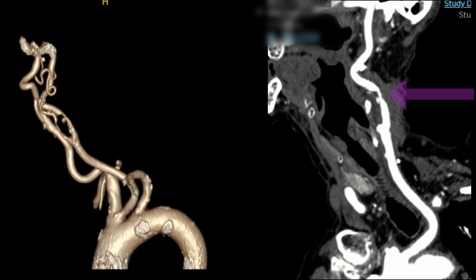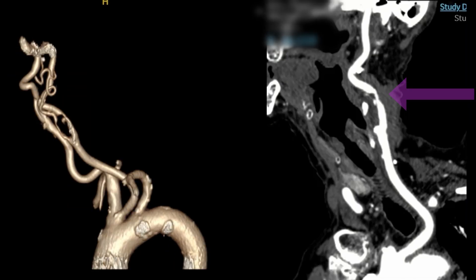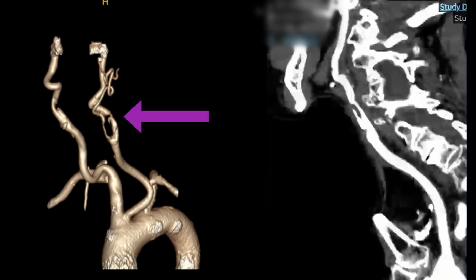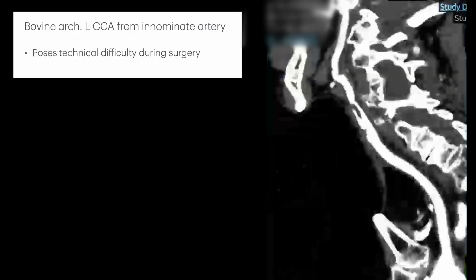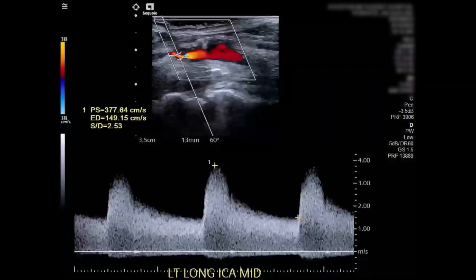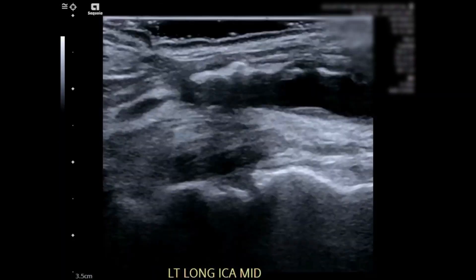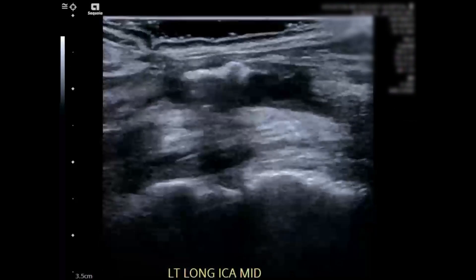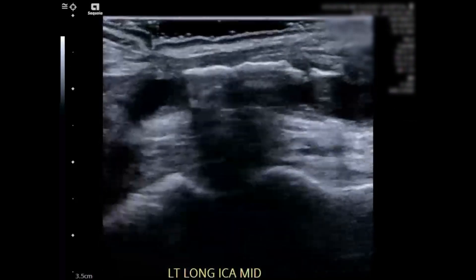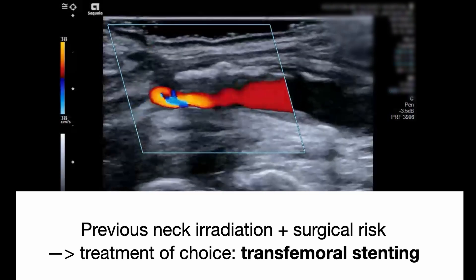CT angiography revealed severe stenosis of the left internal carotid artery, with also significant narrowing of the ECA on the same side. Duplex carotid ultrasound revealed significant stenosis in the mid-portion of the left internal carotid artery with calcified lesions and significantly elevated velocities.